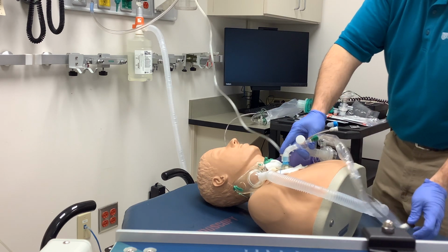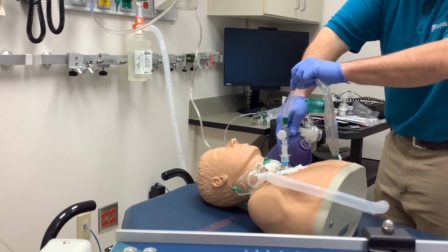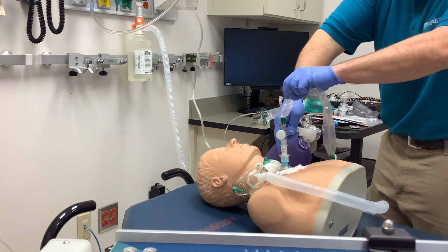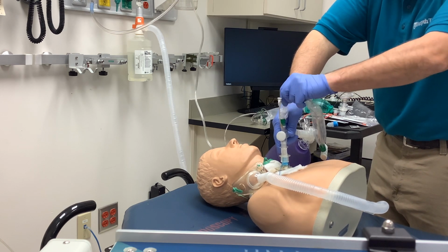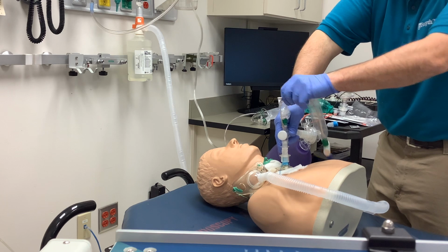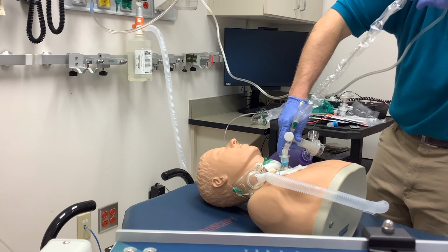And then support. Now, I will tell you that with that Omniflex, you're going to want to make sure that Omniflex is pretty well straight, because if it's not, you're going to have difficulty getting past those ridges in that corrugated tubing. But you'll go down until you meet your resistance, apply your suction, and pull out.